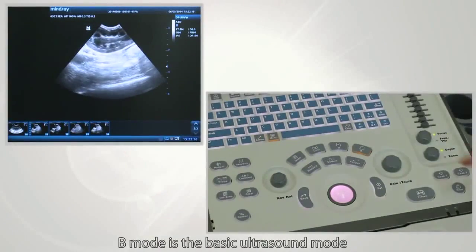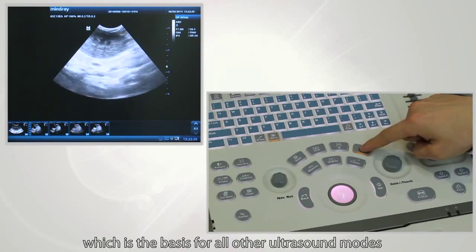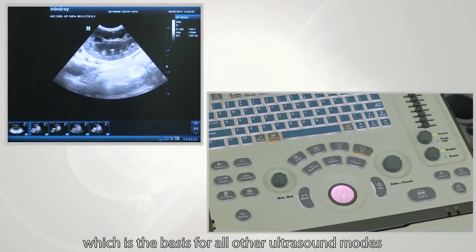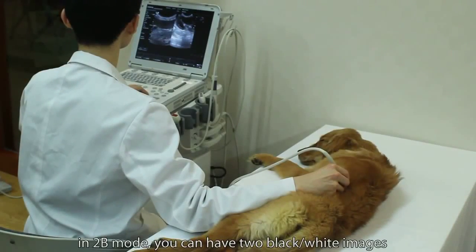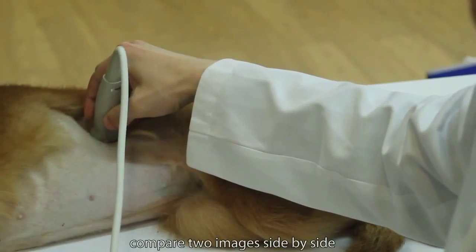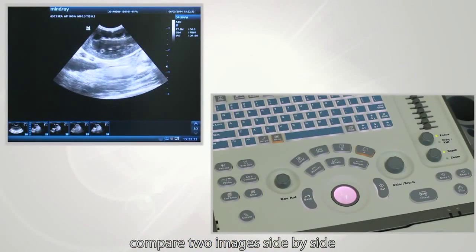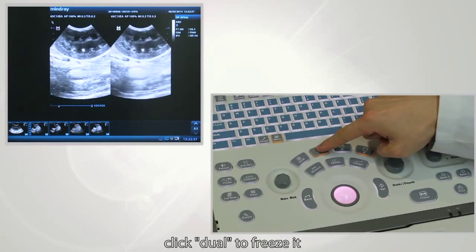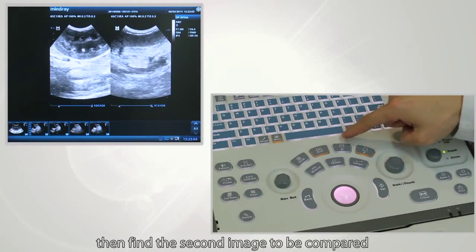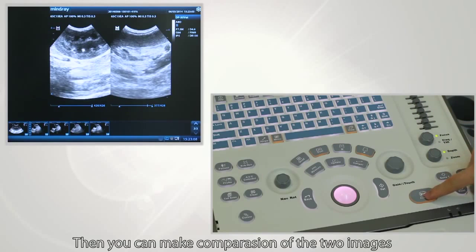B-mode is the basic ultrasound mode and is the basis for all other ultrasound modes. In 2B-mode, you can have two black and white images side by side. Find the first image to be compared and click Dual to freeze it, then find the second image and press Freeze to freeze it. You can then make a comparison of the two images.